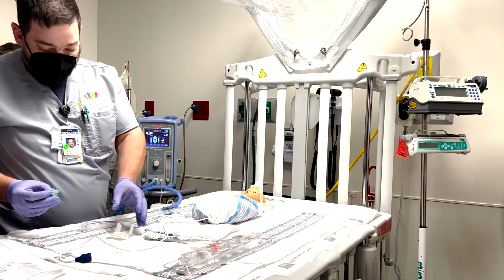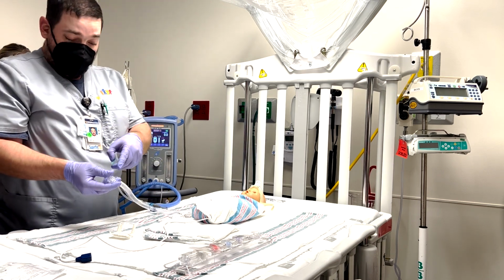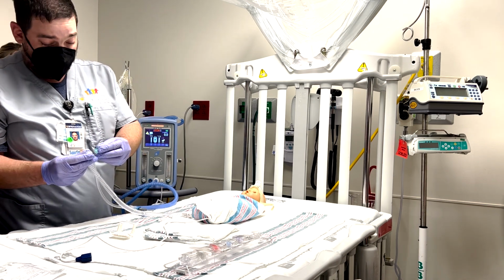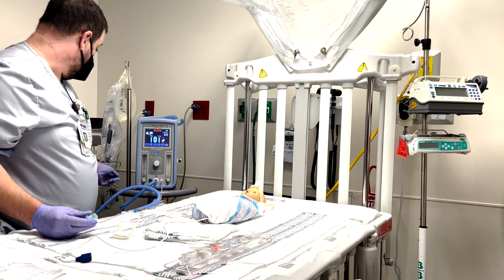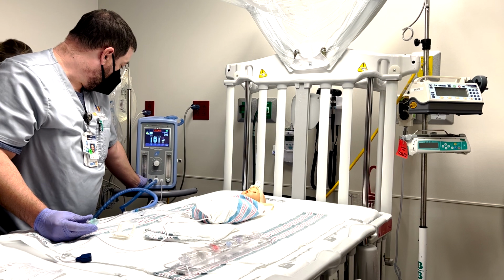So this can only go on one way. There's an indentation here because it works with the tubing. Indentations here, and tubing there. So we go ahead and place our mask on. Say I want a CPAP of 5. I just turn up my flow.